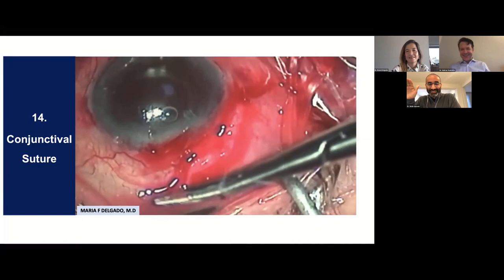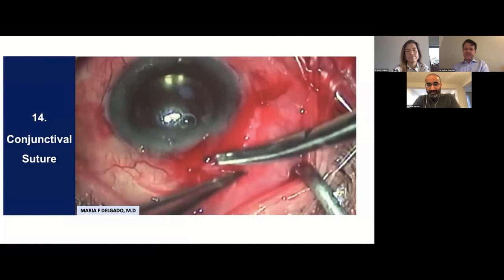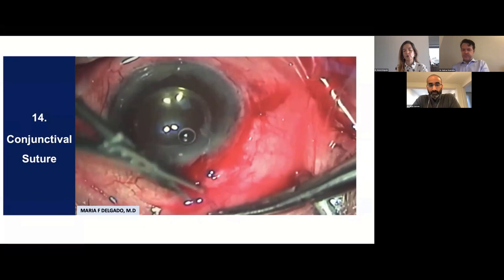Yep. But I think when we get to Nate's video, this is going to be an important point. Suture works very, very well, but glue is not accessible everywhere. So Maria, what were you saying? Sorry to cut you off. Yeah, no, I was saying that we don't have it very accessible, primarily because of the cost, actually. If you're going to just do one case, it's very over the top for the OR. So yeah, but I would love to do it.